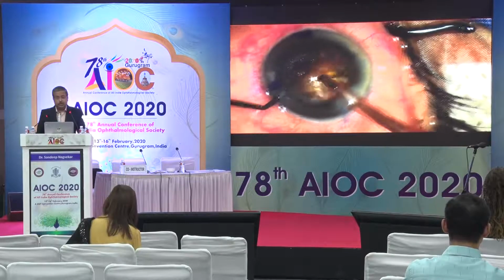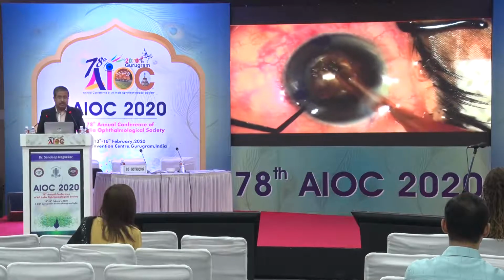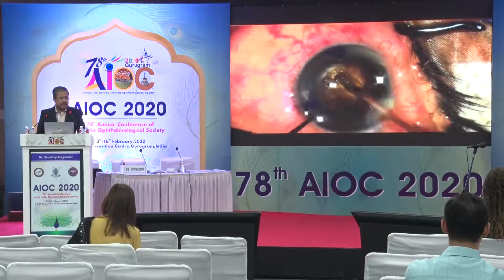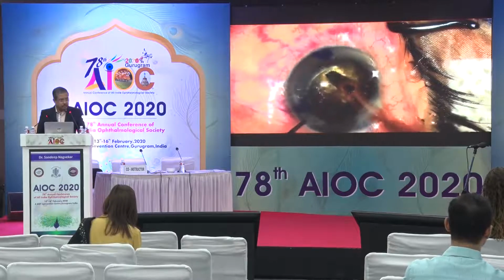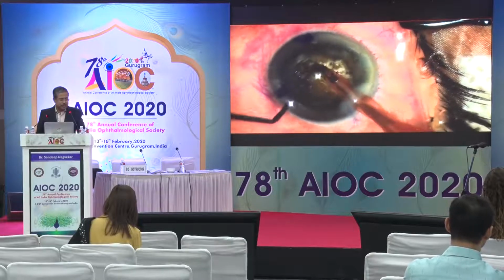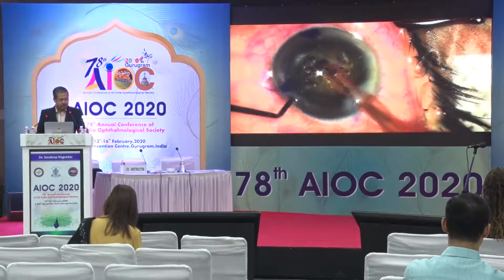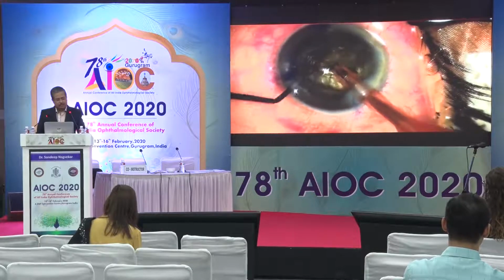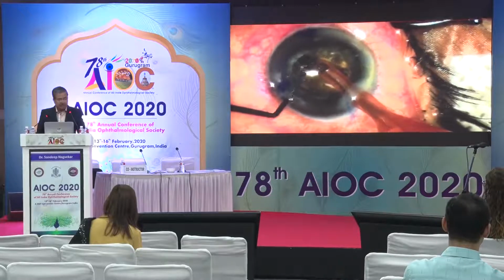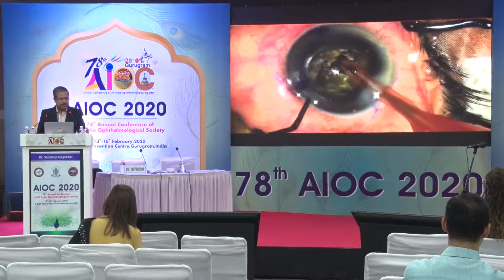When the posterior capsule is not visible, it's very easy to make a mistake. If you do a violent hydrodissection, there can be a blowout of the PC. So make sure that you do a gentle multi-quadrant hydrodissection. Again, make sure you go deep down till you see those leathery fibers at the base. When you see those leathery fibers at the base, it's sometimes not a problem to even phaco in that area, so that you have a really deep trench out there.